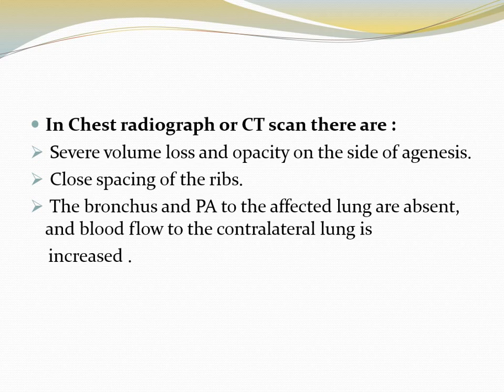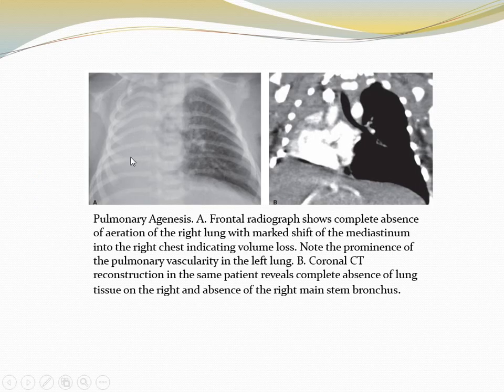On chest radiograph or CT scan, there is severe volume loss and opacity on the side of agenesis, close spacing of the ribs, and the bronchus and pulmonary artery to the affected lung are absent, with increased blood flow to the contralateral lung. Like in this case, there is complete loss of aeration of the right lung and mediastinal shift to the right. The vascularity of the contralateral side is increased. Coronal CT reconstruction of the same patient reveals complete absence of the right lung and the right main bronchus is absent.